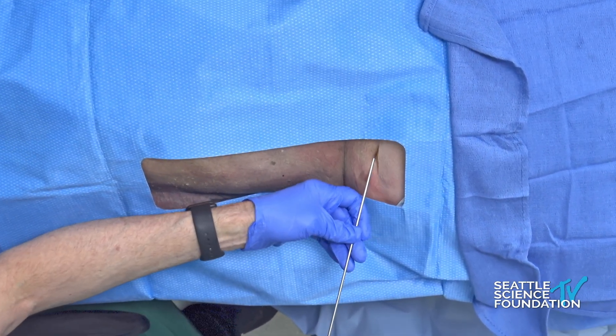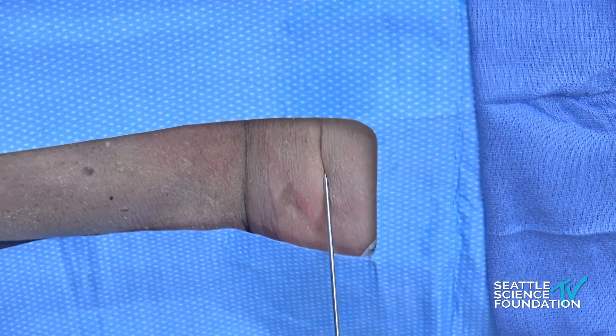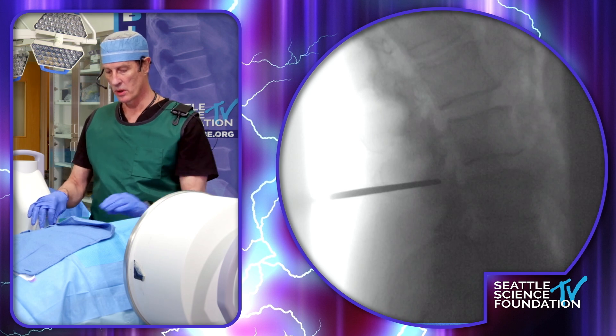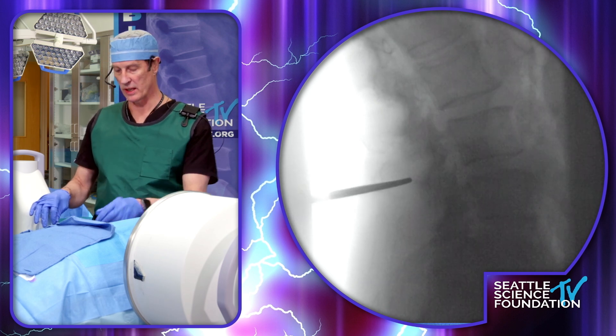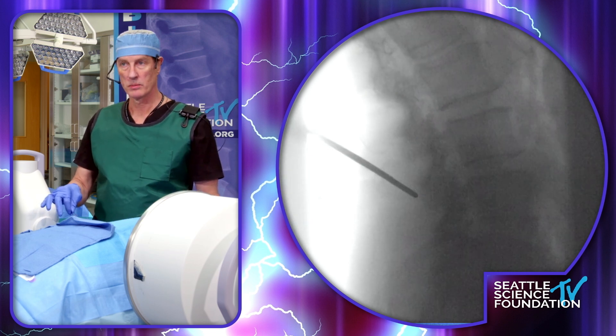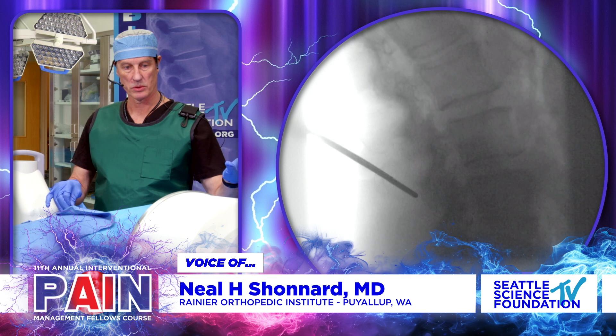We're going to guide this thing all the way down in. You can see that we have a little bit of declination — I want to get up over the top of the hypertrophic facet joint. That's typically what we see. Can you raise the table? There's a little bit too much air, so we don't have good contrast of the bone.